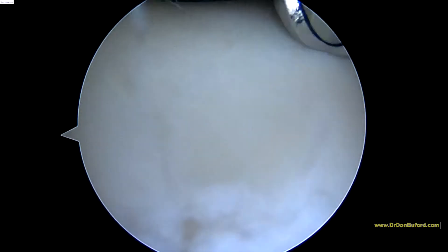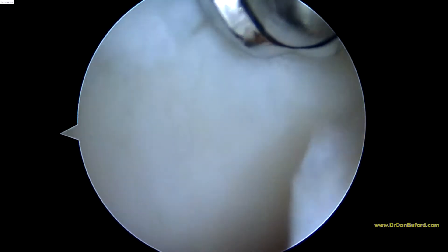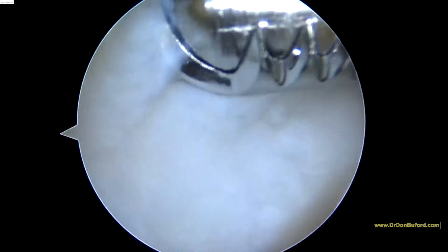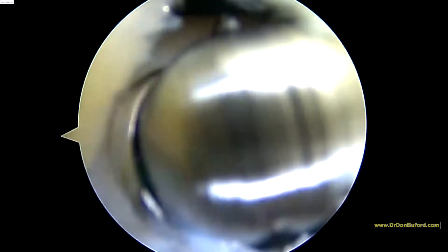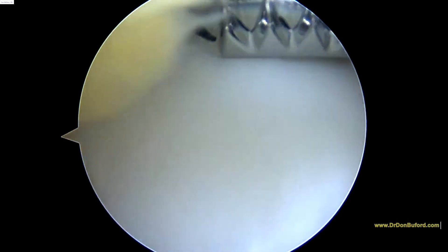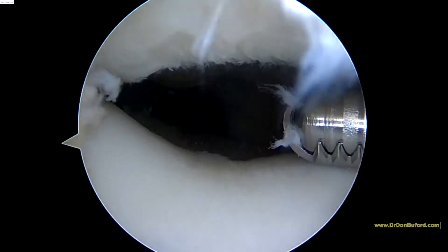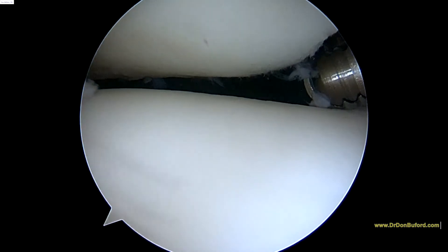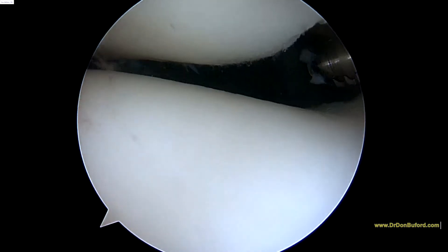We've got a little bit of wear and tear changes as we get down here, but not too bad. Right here it gets a little bit soft, but not too bad. There's the area of the patella at the top of the screen — the more normal lateral facet.